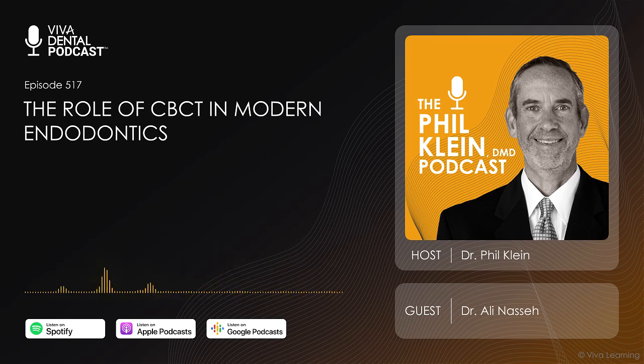If you're an orthodontist and you want to do cephalometrics, or if you want full arch imaging for implants or additional craniofacial imaging, all the way down to very local endo quality images, usually 80 millimeter by 80 millimeter or 40 millimeter by 40 millimeter, small little volumes that reduce the amount of radiation the patient gets and also reduce the field of view.